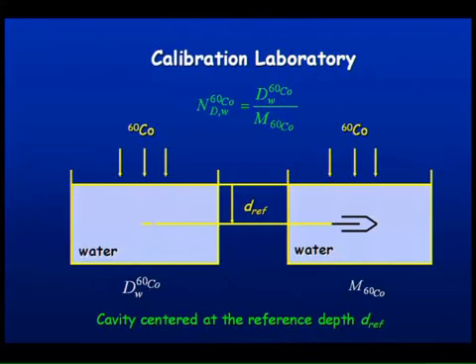So what happens when you send your chamber to Wisconsin ADCL or MD Anderson ADCL or KNS ADCL? They go through different steps. The calibration labs have established the absorbed dose to water at a reference depth, 5 centimeters, in a water phantom for a cobalt-60 beam, by going through different procedures with comparison with NIST and many other means. After you have sent your chamber, they place the point of measurement of the chamber at that reference depth. I'll come to point of measurement in a bit.